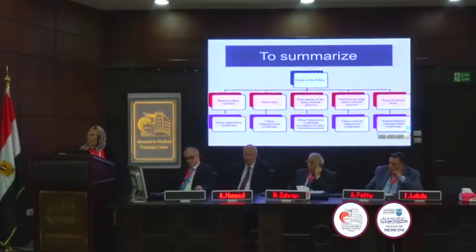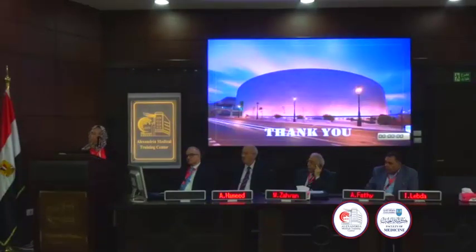If we have non-united styloid process fracture, we can think about the ulnocarpal impaction secondary to the ulnar styloid non-union. If we have excessively long styloid process, we can think about the ulnar styloid impaction syndrome. And finally, if we identify type 2 lunate, we can think about the hamatolunate impingement syndrome. Thank you for your attention.